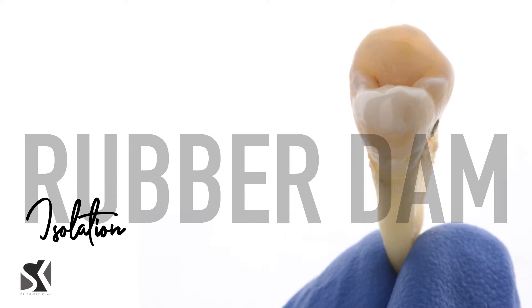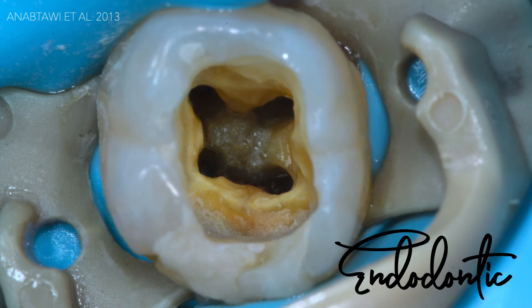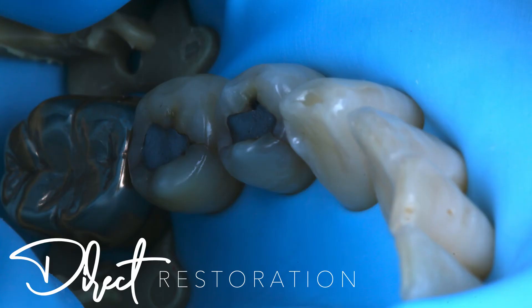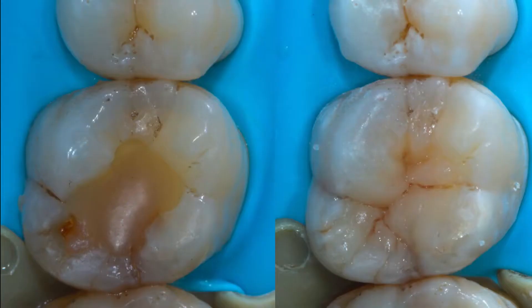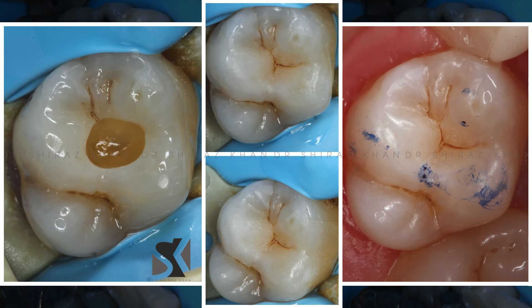We should be using rubber dam for the majority of our procedures, including endodontic treatment — ensuring rubber dam isolation is an absolute pivotal hallmark for predictable and safe endodontic outcomes. I'm also using it for most, if not all, direct restorations, as you can see from this composite replacement case. Here's another example of a simple occlusal that needed replacement: rubber dam just makes your life easier.